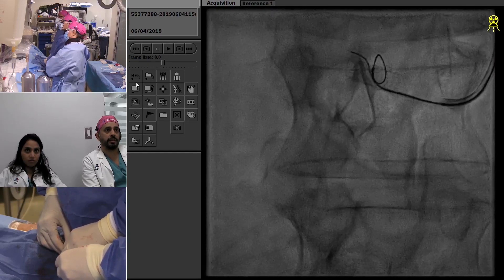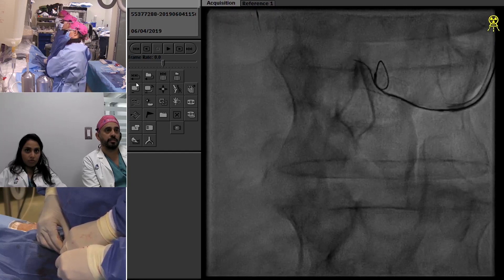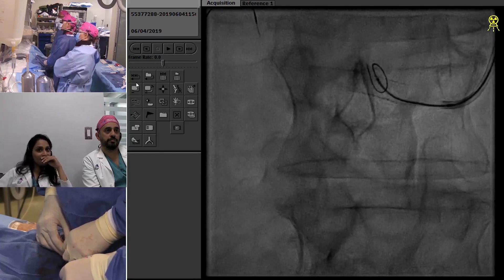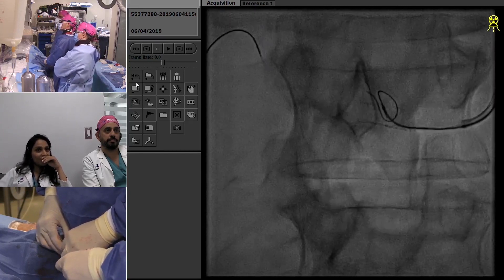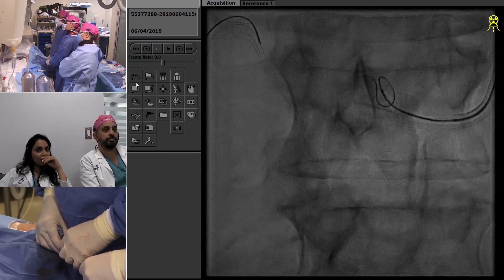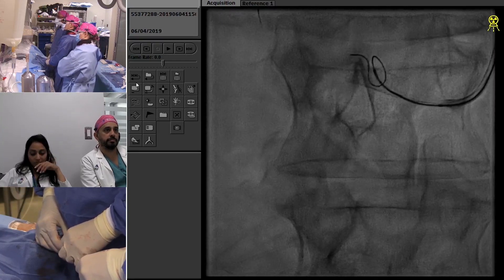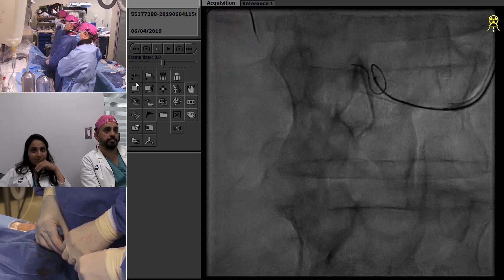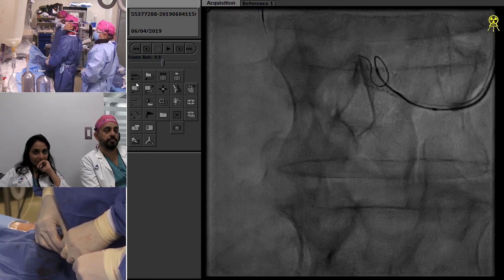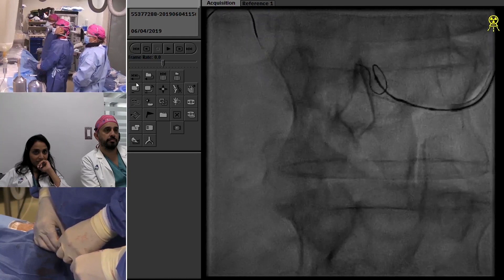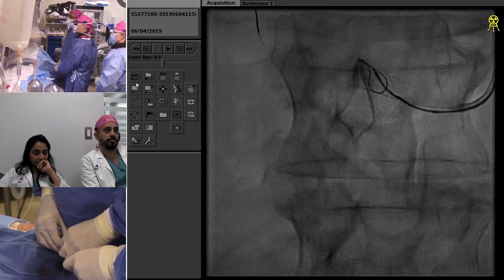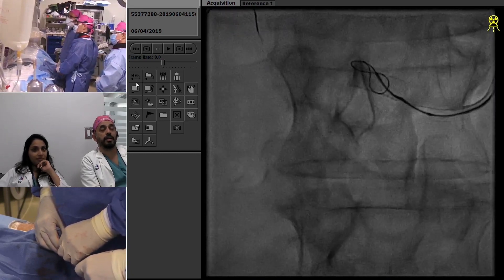To answer how we catheterized the celiac: I used a Sarah Radial catheter to catheterize the celiac, placed an exchange length wire into the splenic artery, then exchanged for the guide catheter. The guide ended up in the celiac, and I used the exchange length wire as a buddy wire to get into the common hepatic. I deliberately did not want the exchange length support wire crossing across the aneurysm — that wasn't good form.